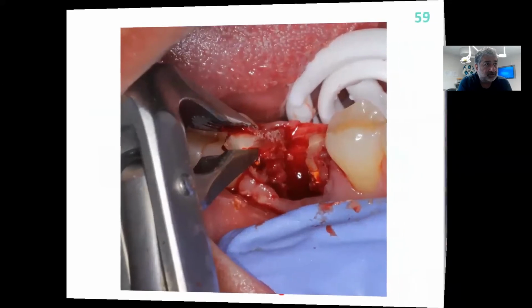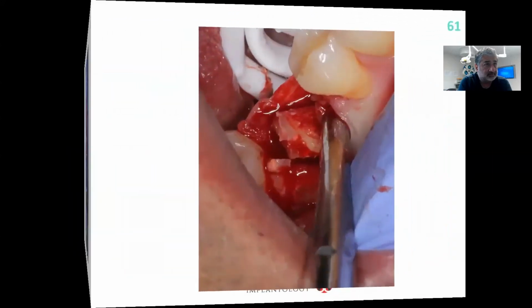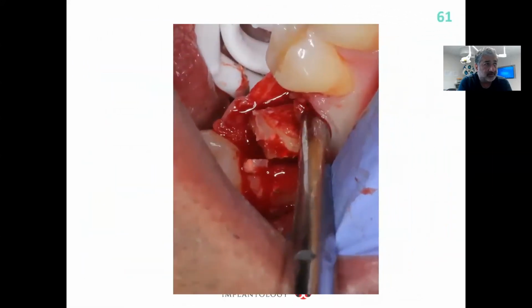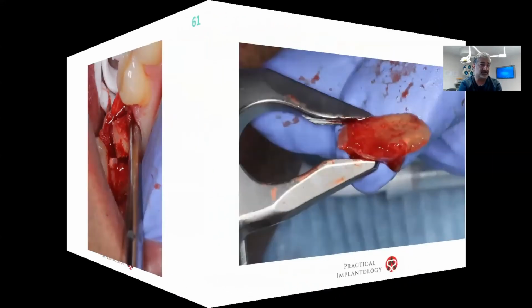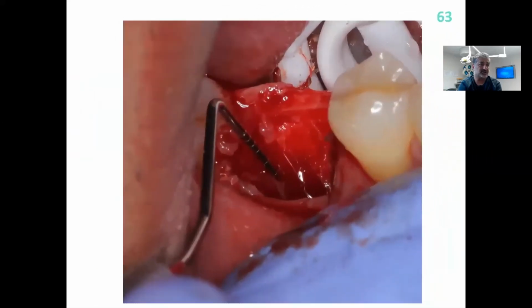It became loose, and I took the teeth out in bits and had a good look at the tooth. Now that mesial root will fall into the gap where the distal root has been taken out, and I again had a good look. I checked the architecture of my socket.